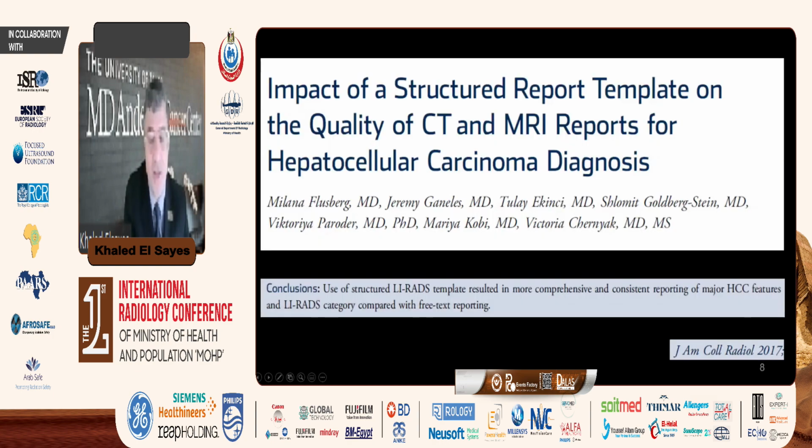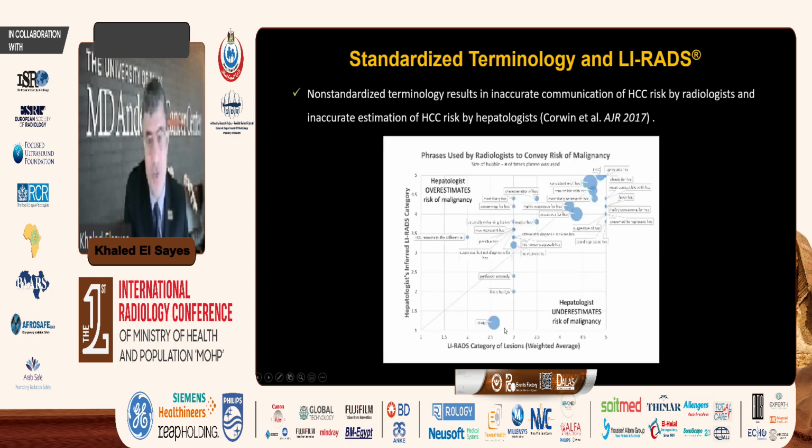This has an impact on the diagnosis or the diagnostic quality of your report for hepatocellular carcinoma, and it was found that the use of a structured LI-RADS template resulted in more comprehensive and consistent reporting of major hepatocellular carcinoma features and LI-RADS category compared with free text reporting. And I showed you an example of this.